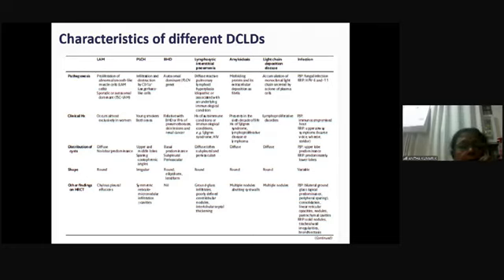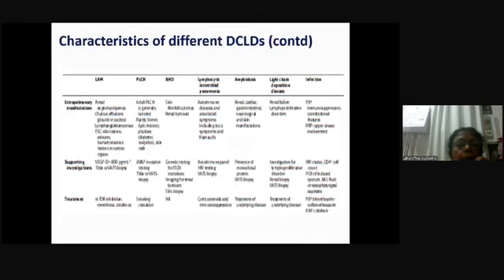Whereas in LIP, it is usually associated with autoimmune conditions or immunological conditions like Sjogren's syndrome or HIV. Then the characteristic features of the cyst that has all been described. Then other findings in HRCT, that is important. For LAM, you can see associated chylous pleural effusions. PLCH, you see the nodules as well. Birt-Hogg-Dube, there are no associated features, and LIP, you see ground glass opacities, poorly defined centrilobular nodules, interlobular septal thickening is also present.